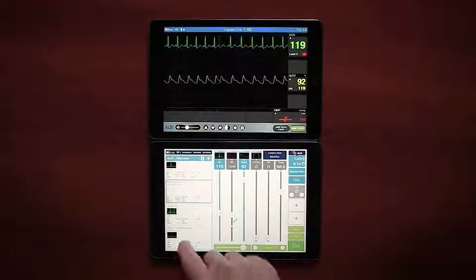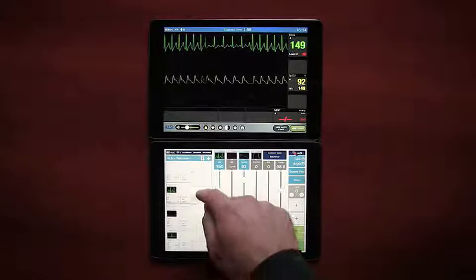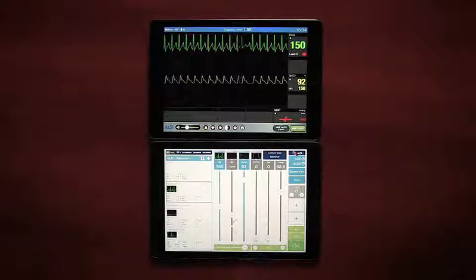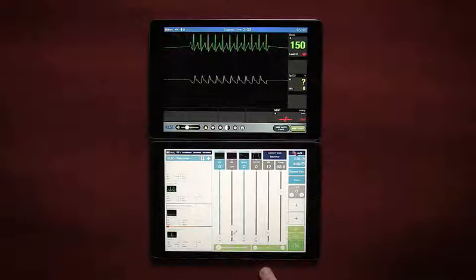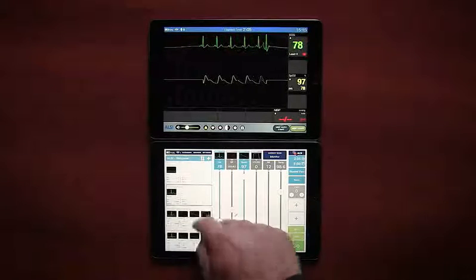If we wanted to dial it up a little bit and mimic giving medication, we can put the patient into SVT, and perhaps the course of action is to give adenosine. So we get that 3-second period of asystole before it jumps back into its normal sinus rhythm.